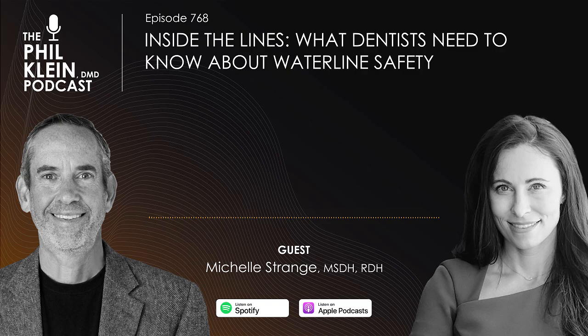So that shock, tell us about how it's actually done and when it should be done as far as the frequency, and also should you stay within the same system as far as the company that makes the test equipment, the shock equipment, and the maintenance equipment? We haven't got to maintain yet. We're going to talk about the maintain phase in a second. But shock treatment, if you're getting passing grades or less than 500 CFUs on all your testing, you still shock though? Yes. So that's the first part there, I would say.